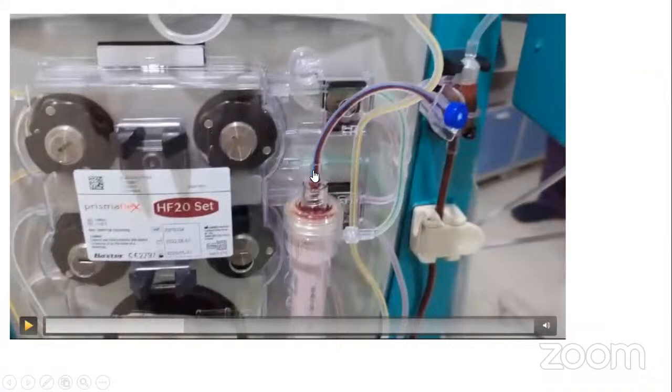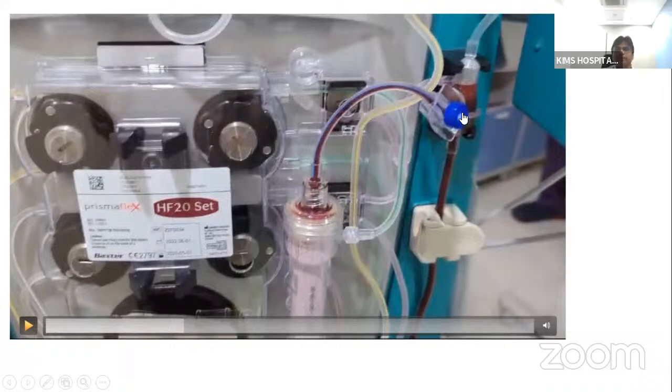Once the blood goes through the filter, it goes through the de-aeration chamber. This is an interesting part in CRRT. Whenever there are any air bubbles, they get collected here and are removed through this part. If you are using post-dilution replacement fluid, it gets added here. If you see this part, there won't be any direct contact between the blood and the air.